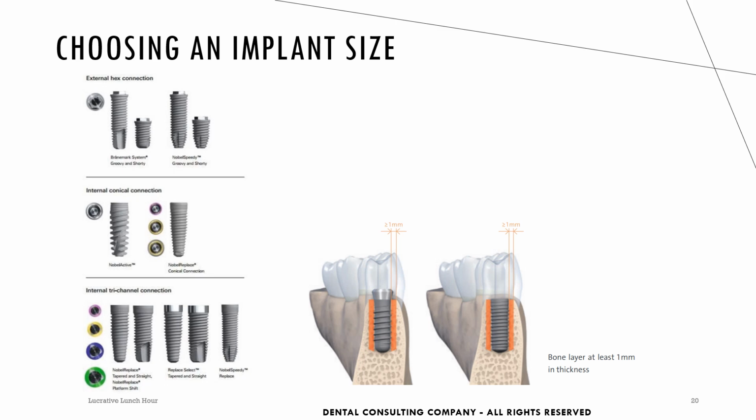There are many different types of implants. I would recommend looking to see what implant system your practice uses and ask your DDS why they like that particular brand to gain a better understanding of the process for treatment planning and determining whether or not a patient is a candidate.